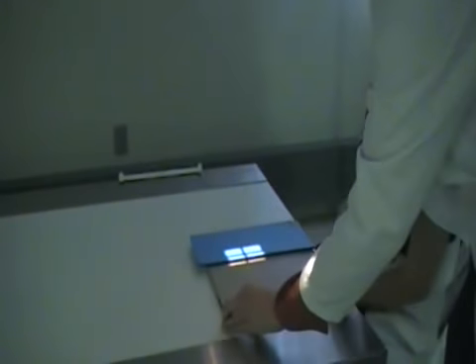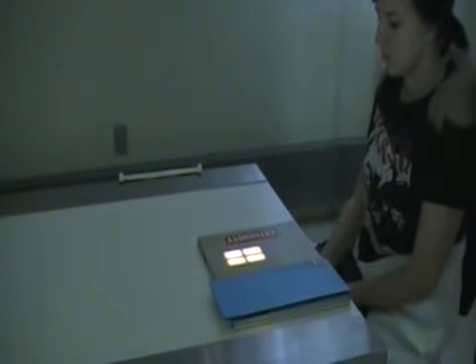So I'm going to let her lift up her head. I'm going to adjust my cassette, and I'm going to put my image on the other side. So put the left side of your face down, and I'm going to get it centered to the other half. So I'm going to scoot you forward a bit.